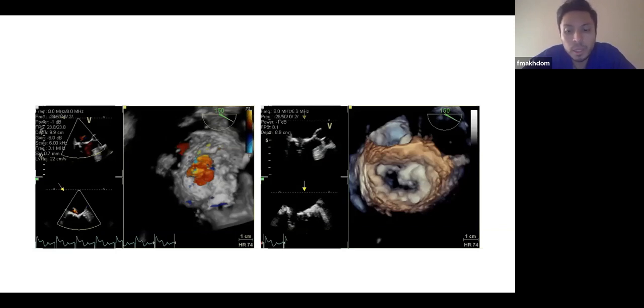The other option, if the calcification is not as extensive, is that you can just do atrial advancement. When you decalcify the annulus, the gap between the atrium and the ventricle, you can put stitches in the atrium and advance it to the ventricle. Another option is taking pledgeted sutures from the ventricle to the atrium and bringing them together.